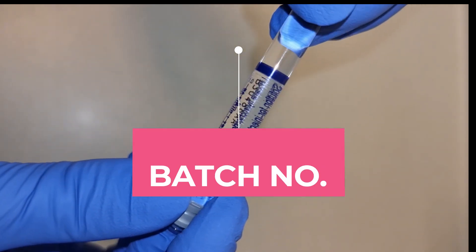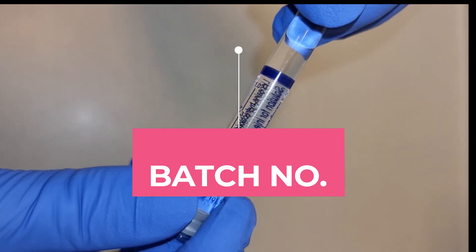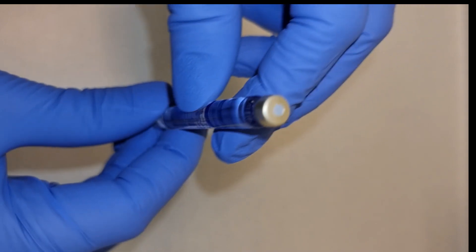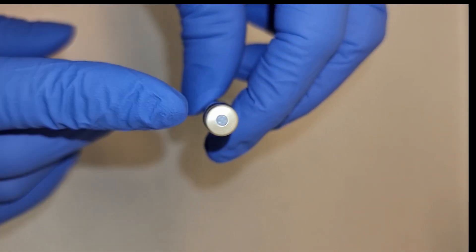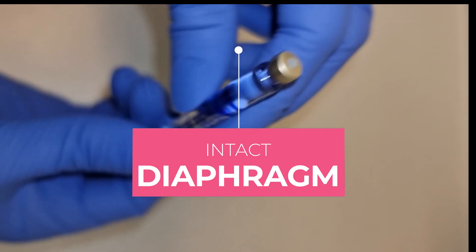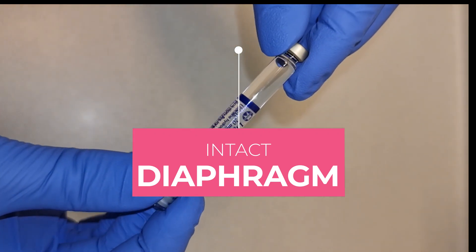Then you've got the batch number—it's important to record the batch number. And then you also make a final check to make sure that the diaphragm is intact to ensure there has been no tampering of the cartridge itself.